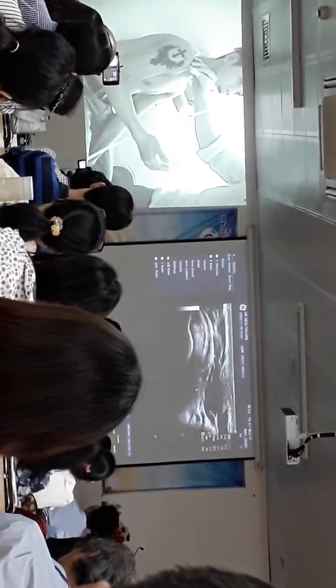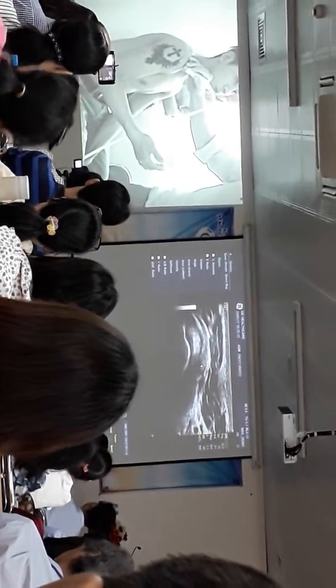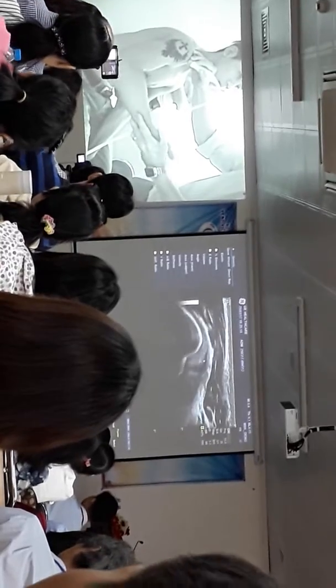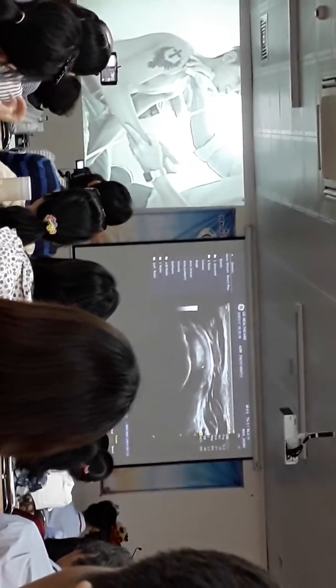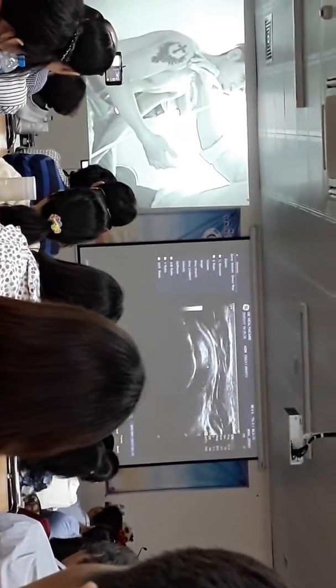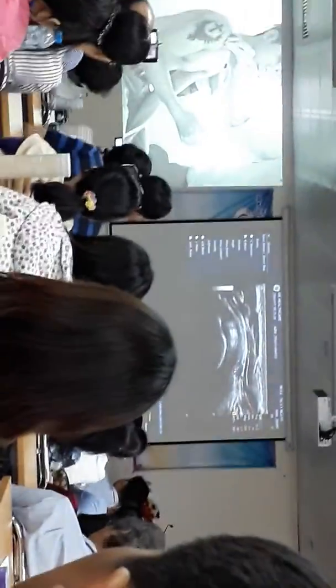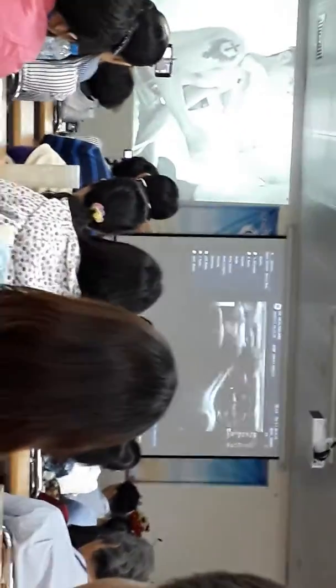If I turn on that, there it is in short axis. So you can see this is the bursa. So it's just at that point. So this patient is getting a little bit of a rub of the bursa underneath that CA ligament. Khi mình cho bệnh nhân cái vận động cái cánh tay thì mình sẽ có sát cái sự trượt của cái bao bọc dịch dưới phần cùng này so với cái dây chằng và cùng.